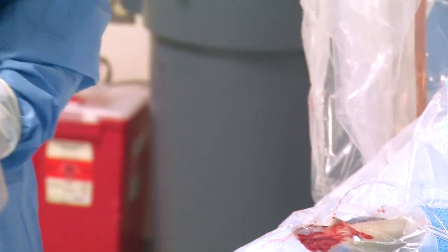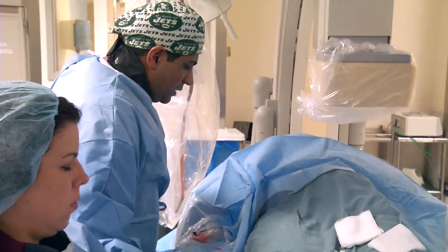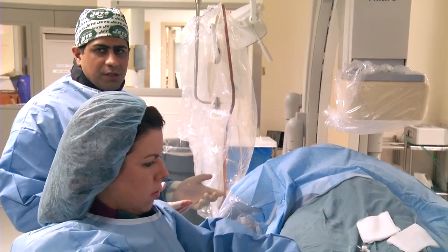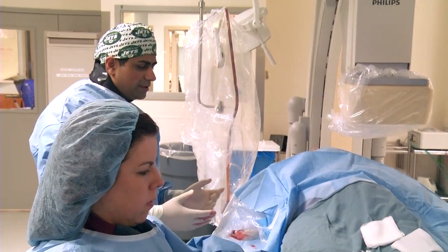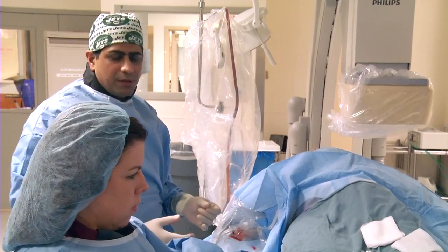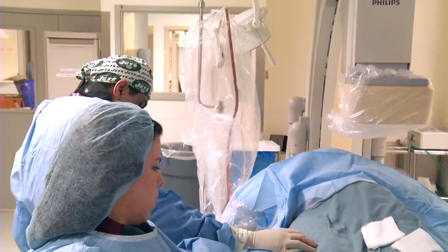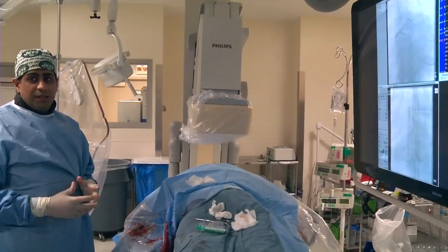Okay, once the sheath's in, we bring the arm in, and now this simulates a femoral approach. One of the concerns people often have in doing radial is that the radiation level may be higher, since you're working out over here, but as we see, it's pretty similar to the rest of the procedure. And now we'll perform an intervention on that. So we've concluded the intervention.